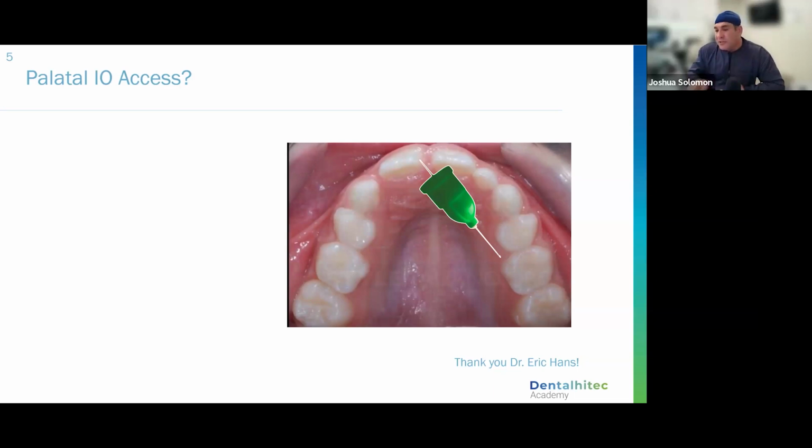In dental school, I think that was the last time I actually gave a palatal injection. But in my experience, there's no different sensation whether you deliver that stage 1, 2, and 3, or stage 1 and 3, either on the facial side or the palatal side. So I will routinely, if I'm working on I&J, give a palatal injection here.